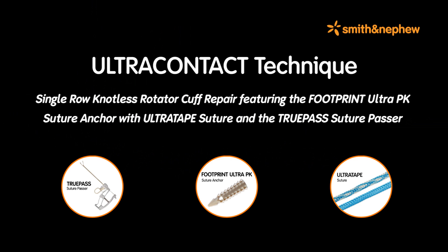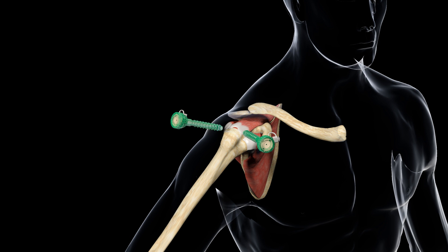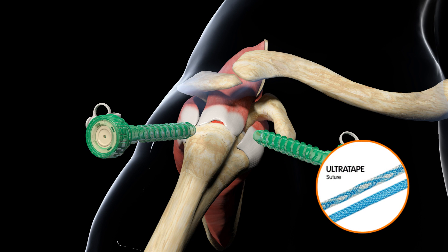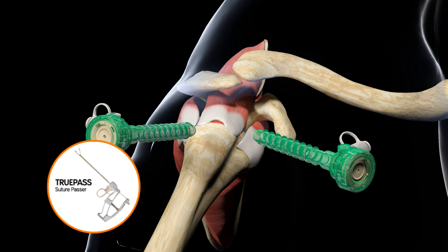Single Row Knotless Rotator Cuff Repair featuring the Footprint Ultra PK Suture Anchor with Ultra Tape Suture and the TruPass Suture Passer. In this Smith & Nephew Rotator Cuff Repair Technique animation, the knotless repair of a small tear in the supraspinatus tendon will be demonstrated. This repair will utilize Ultra Tape Suture, a flat, uniformly woven suture tape designed to increase tendon to bone contact, the Footprint Ultra PK Suture Anchor with interlocking screw technology, and the TruPass Suture Passer which simultaneously passes and retrieves suture or Ultra Tape in one step.